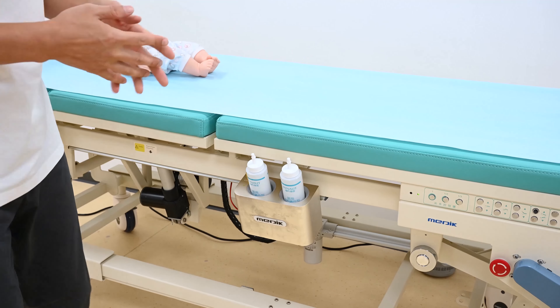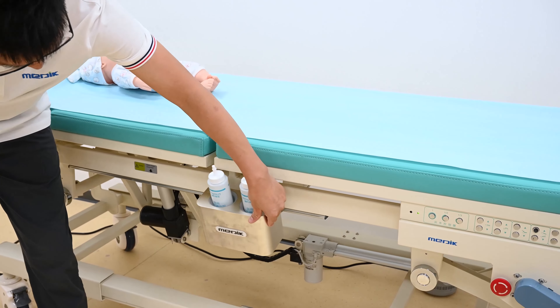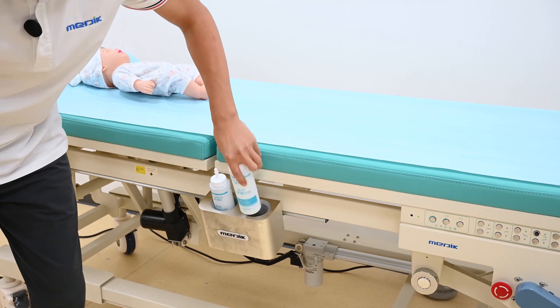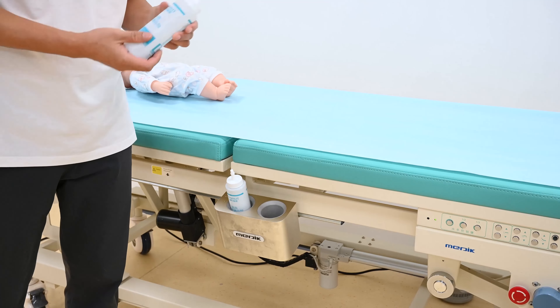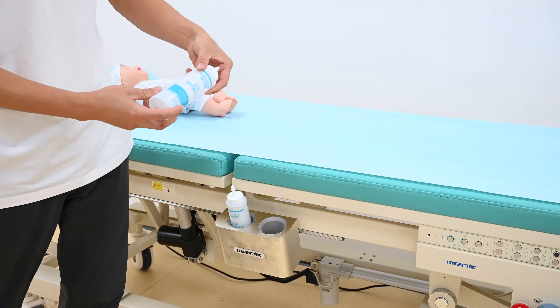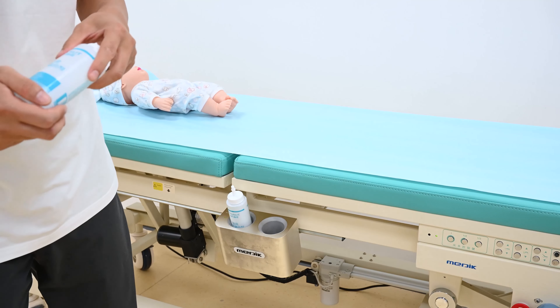The third function for this table is the heater, which can slide along the orbit. The heater is equipped for the purpose of heating the ultrasonic gel. Normally, the patient feels cold when the liquid is applied to the body. But with the heater, the temperature rises — the gel bottle will be heated, so the patient will get a better experience.